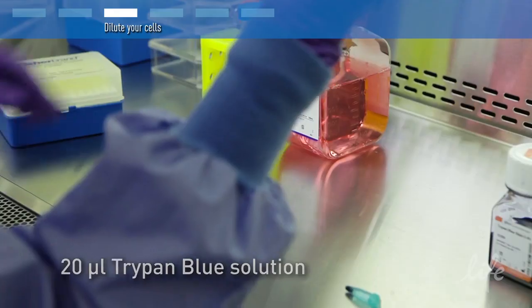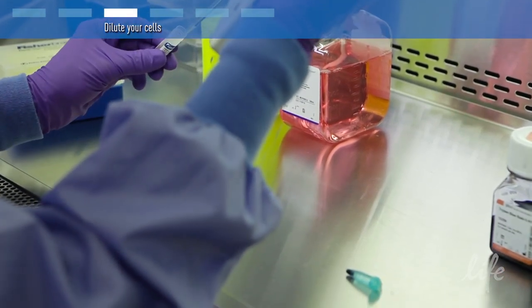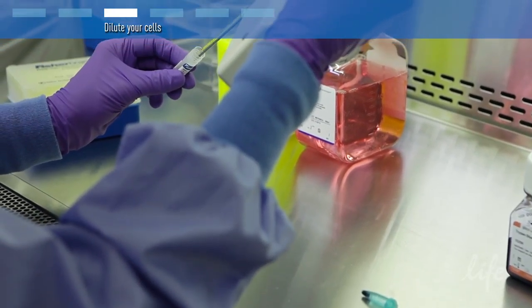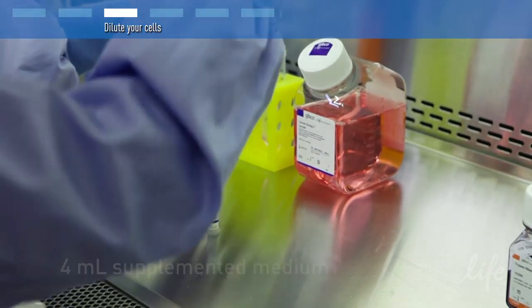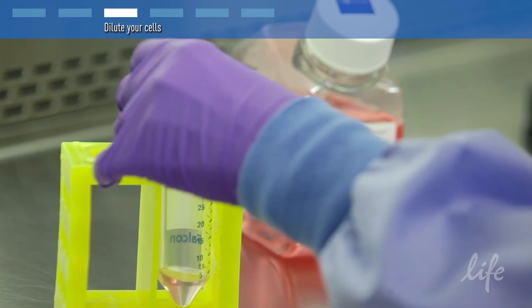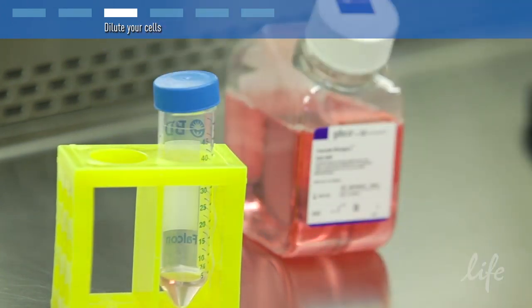Use the same 1 ml pipette to remove the remaining cells from the original cryovial and dilute into 4 ml of supplemented medium in a 50 ml conical tube. This step reduces the cell's exposure to DMSO in the cryomedia.